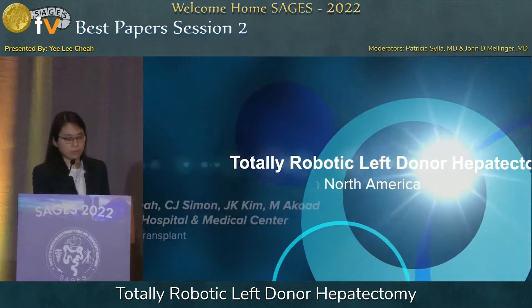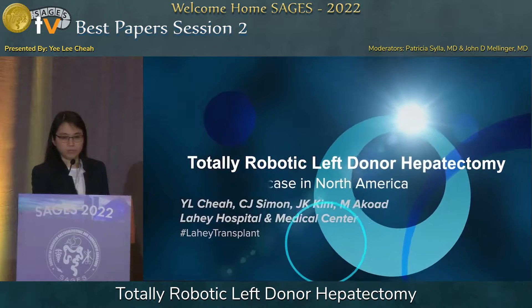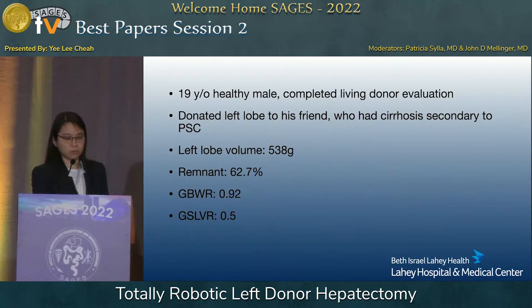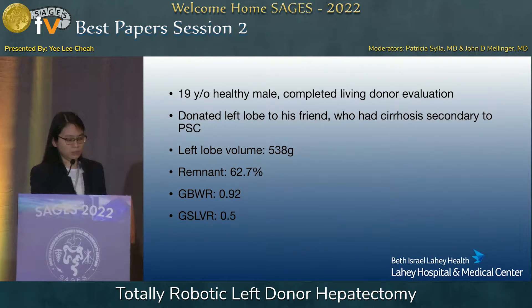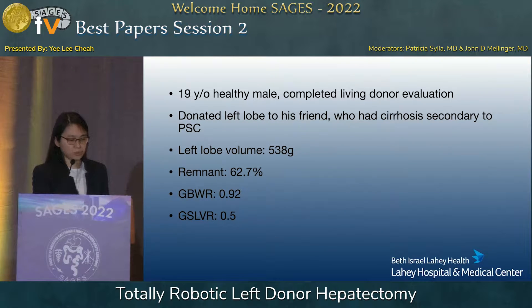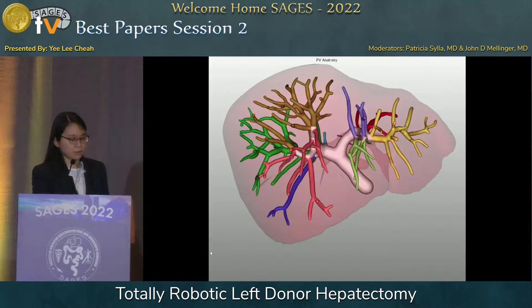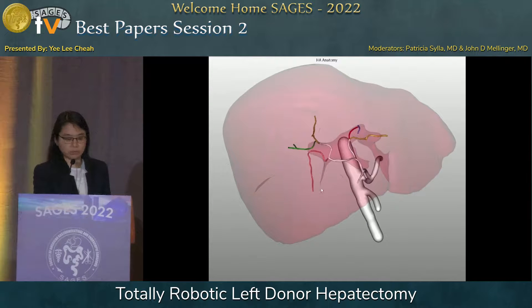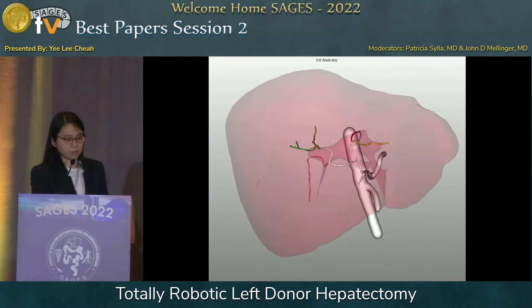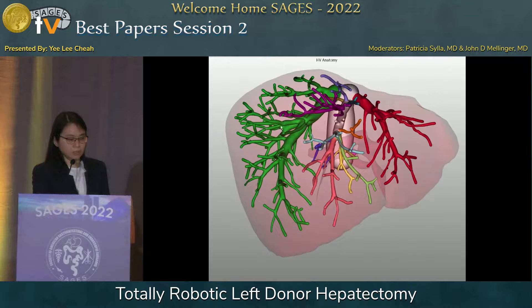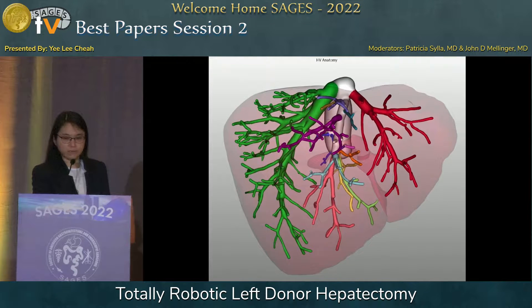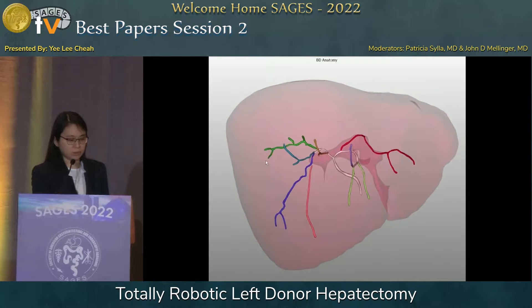Our donor is a 19-year-old man who underwent a full living donor evaluation and was deemed suitable to donate his left lobe to a friend who had cirrhosis secondary to PSC. His left lobe volume was 538 grams, leaving him with a remnant of 62.7%, and the graft-to-body-weight ratio was 0.92 — all appropriate numbers. This is a MEVIS 3D reconstruction of his liver, showing normal portal vein and hepatic artery anatomy, which are standard.